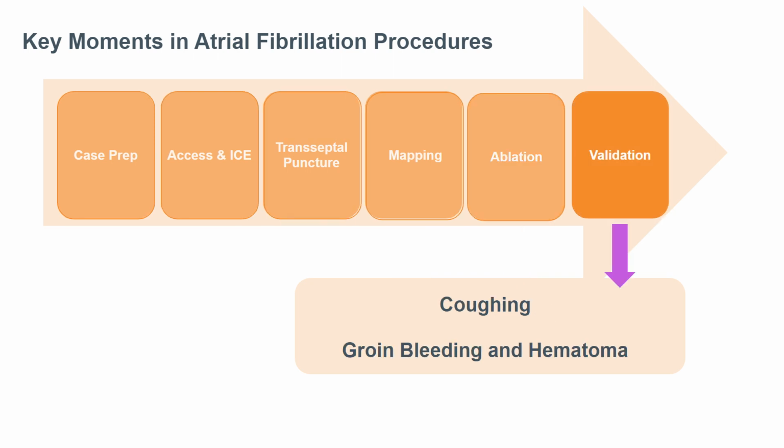As the procedure finishes during validation and the patient begins to wake up, coughing may lead to bleeding and a hematoma at access sites. These are just a few of the key moments the provider may consider during an atrial fibrillation procedure.